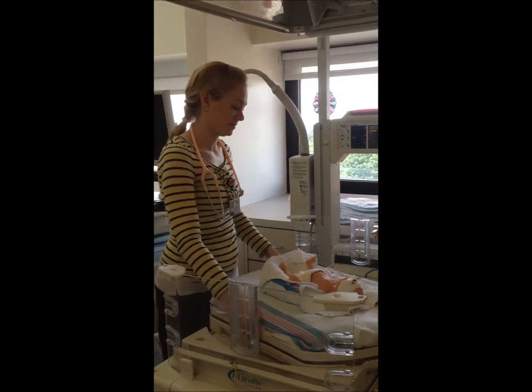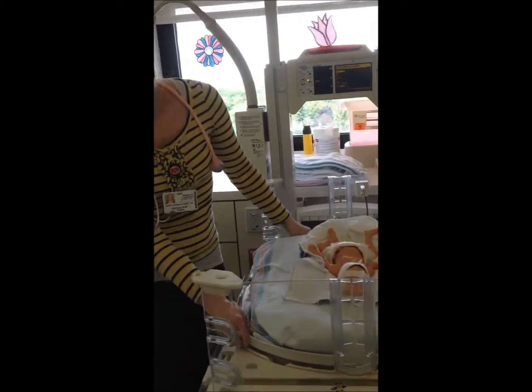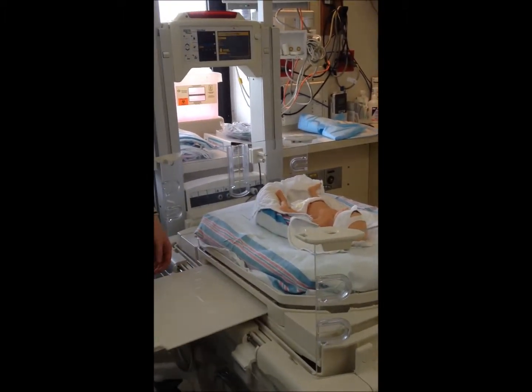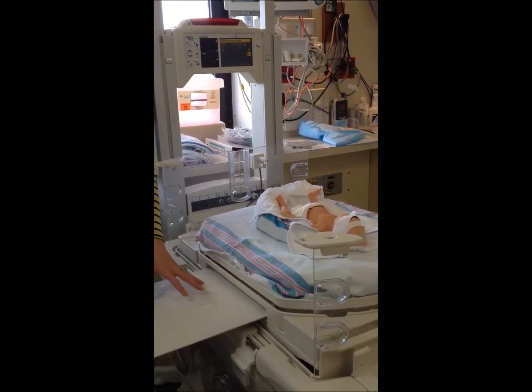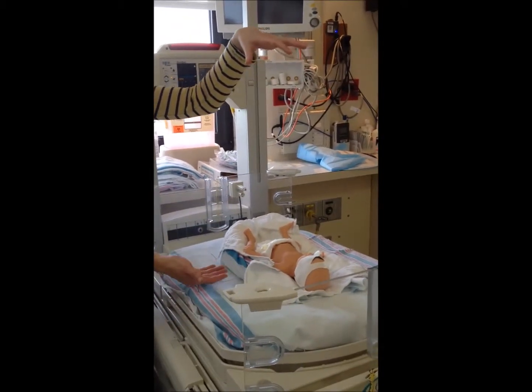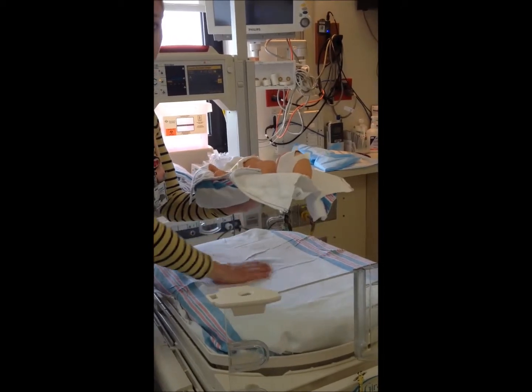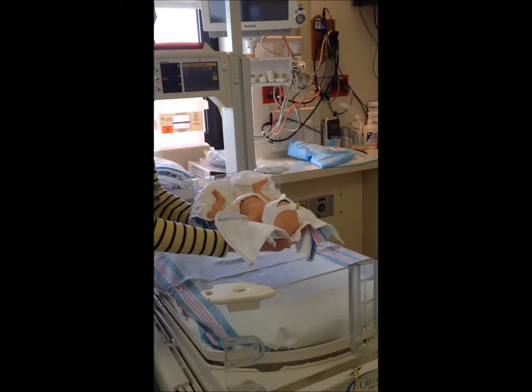Great. And also, if you had to do an x-ray on a baby this tiny, isn't there a special feature on the bed that allows you to do that without ever moving the baby? Exactly. Yet another way that we don't have to disturb the babies as much is there's a special tray on these beds that the x-ray technicians can place the film for the x-ray on, and we can slide it underneath so that they can take the picture from the top and it registers on the film down below. If we did not have the little baby in the giraffe bed, we would have to lift the baby up like this and put the film right here. And oftentimes that's actually, in addition to the trouble of moving the baby, very uncomfortable.